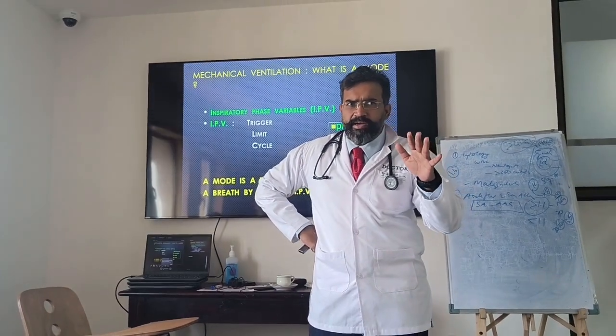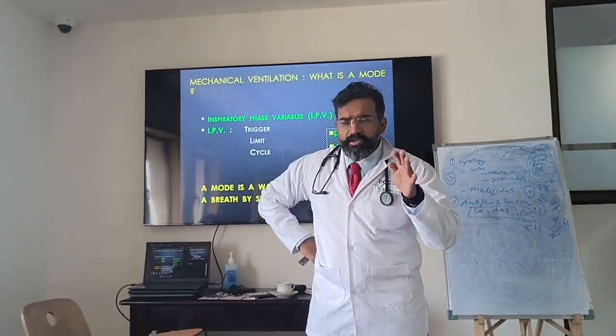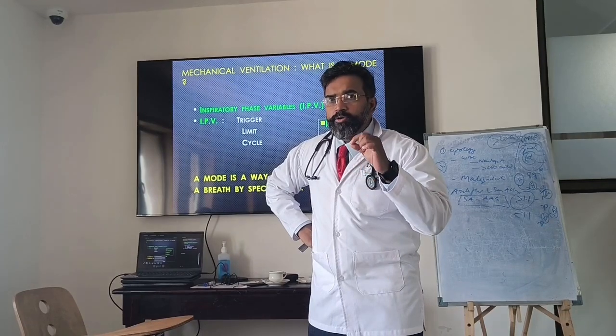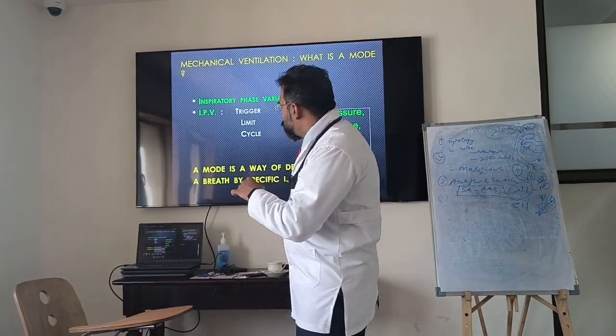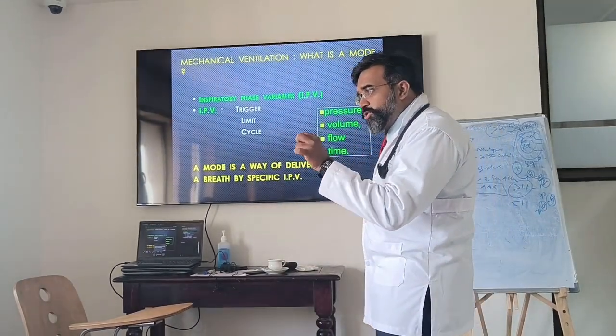I love mechanical ventilation. It's something I like to do again and again. I can talk to you for hours on mechanical ventilation, but what I'm doing today is something that you need to know. Without knowing this, you can't ventilate patients. It is harmful to ventilate a patient if you don't know these things. So trigger, limit, and cycle is how you describe any breath.